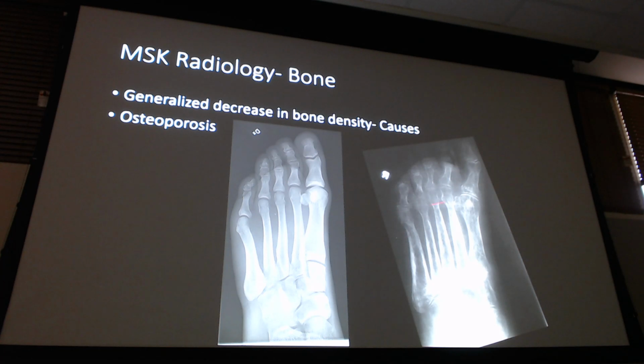And then here's my abnormal. There are no fractures in this right now. This is just pure osteoporosis. I want you to focus on the medullary and the trabecular bone area on the two x-rays. This is how you find it incidentally. You dropped a can on your foot, and I got the x-ray, there's no fracture, but have you ever been diagnosed with osteoporosis? No. Let me go ahead and order you that DEXA scan and get this looked at, because we may need to get you on some meds to try to prevent actual fractures in the future, right?